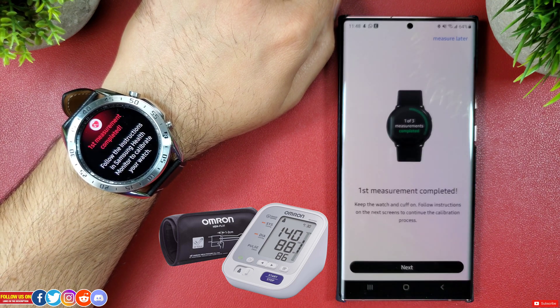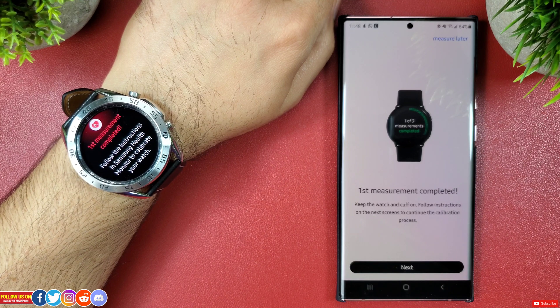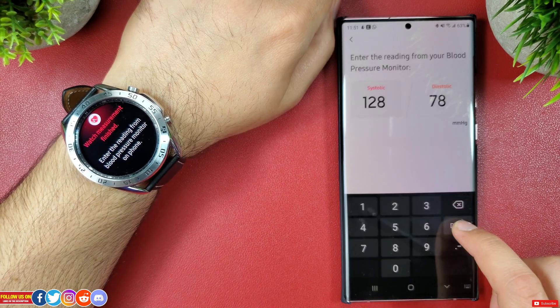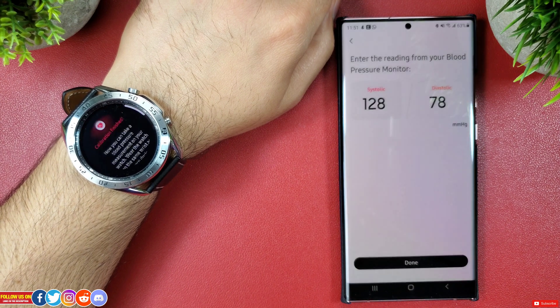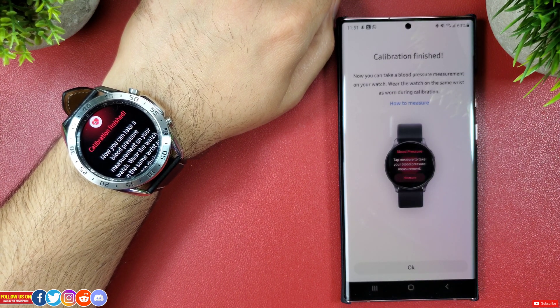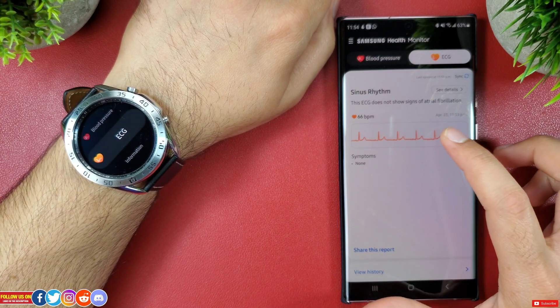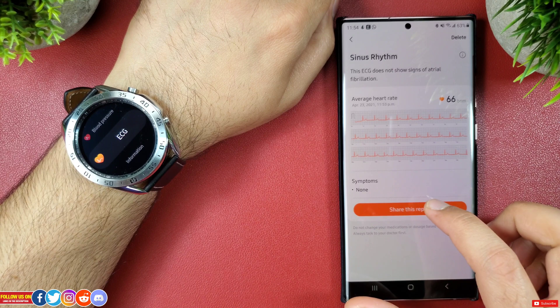With the first measurement done, you'll have to take 3 more measurements identical to the first one. After which, you will get a prompt that the calibration has finished. You can even share the ECG report in PDF format to your primary healthcare provider.